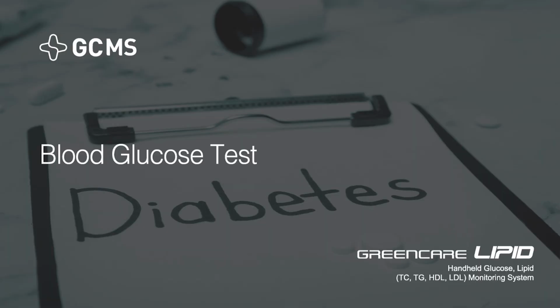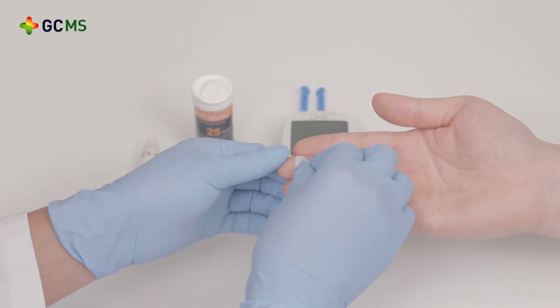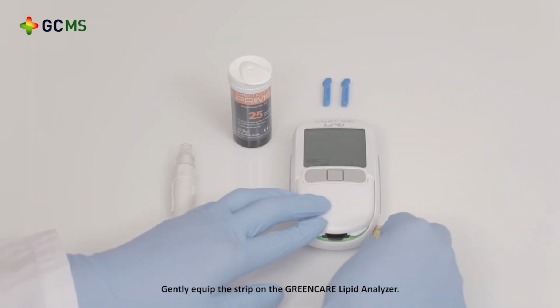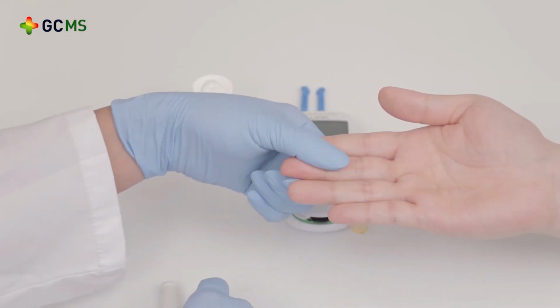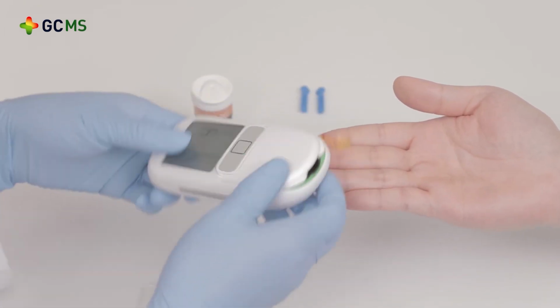Blood glucose test. Complete the test as described for the capillary tube sample. Using the alcohol swab, clean the finger and allow it to dry completely. Before pricking the fingertip, gently equip the strip on the GreenCare Lipid Analyzer. Then prick the fingertip using a lancet. Then gently squeeze the punctured area to obtain the blood sample. The required sample volume is 0.5 microliters.